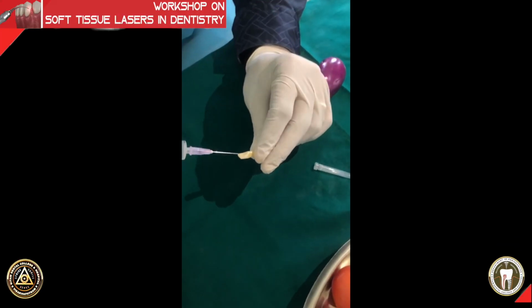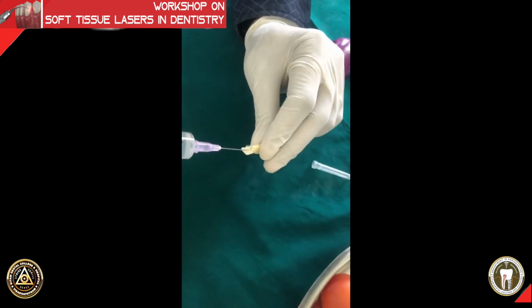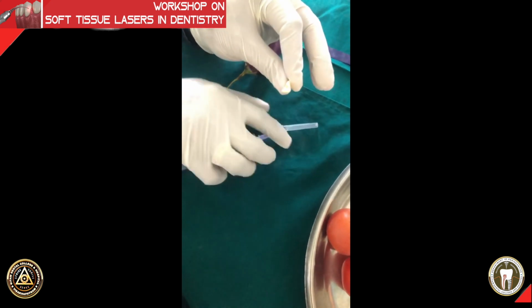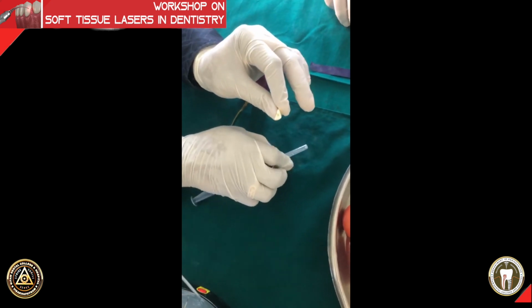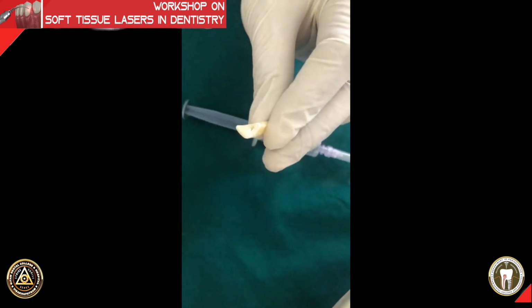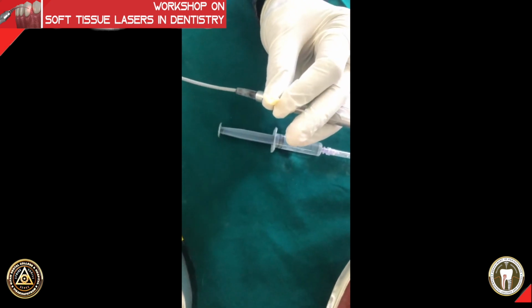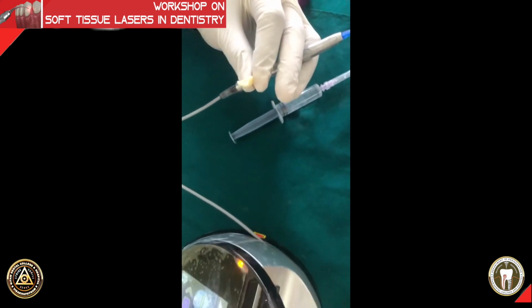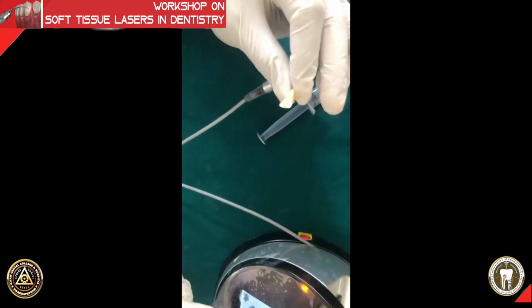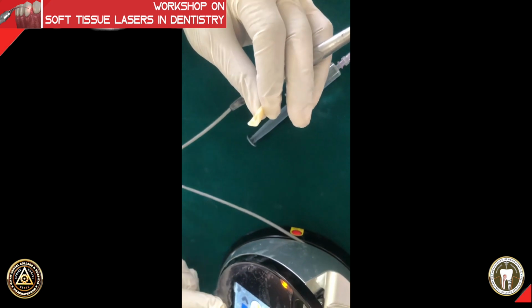So good afternoon. Now we are going to carry on with the preclinical exercise on root canal disinfection. The first step is irrigating the canal. The canals should be prepared at least till ISO 25 or ISO 30. The ISO 30 correlates with the tip diameter of 200 microns, which you will be using for the root canal disinfection.